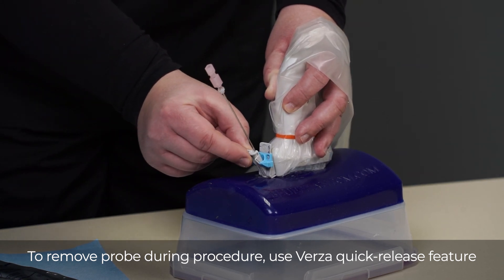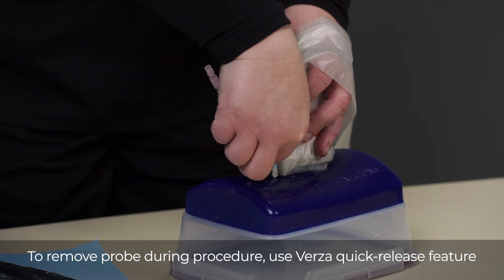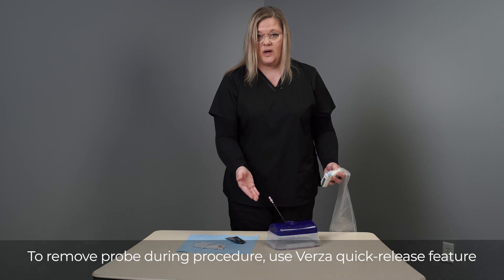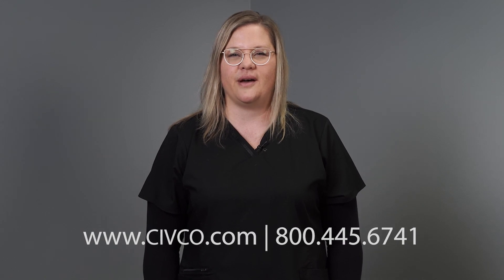You'll take the tab and rotate it all the way over until it clicks, and now you can remove your probe easily to continue on with the patient procedure. For more information regarding the Versa guidance system, please visit civco.com.